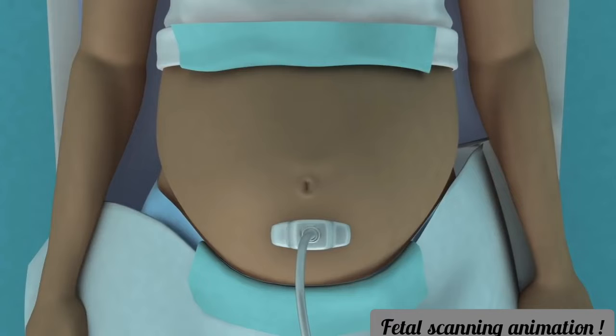The probe can only be moved in 4 ways: by sliding, rotating, dipping, or angling. ISUOG recommends using the 6-step approach for the performance of a basic 2nd or 3rd trimester obstetric ultrasound examination.